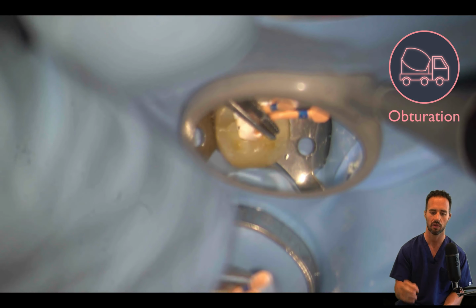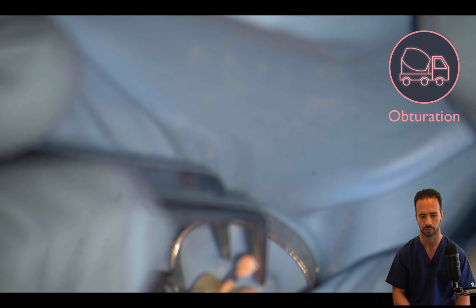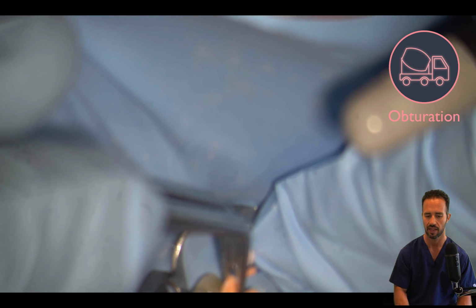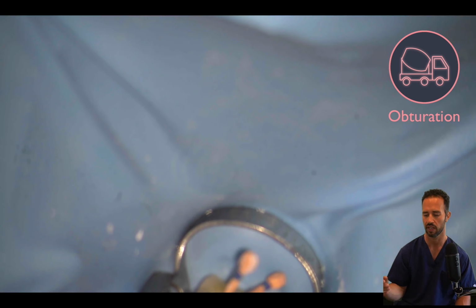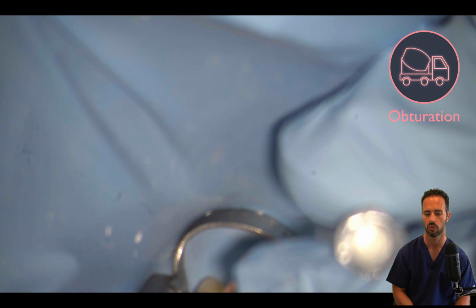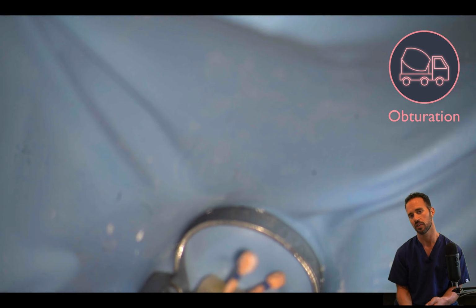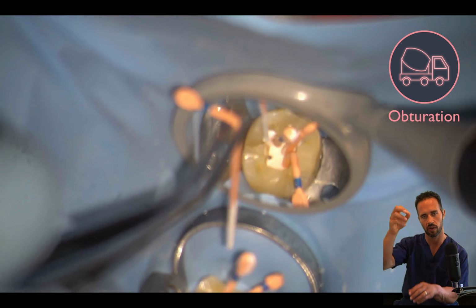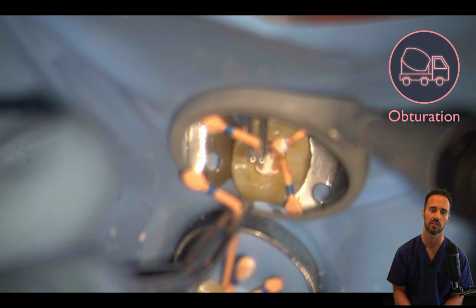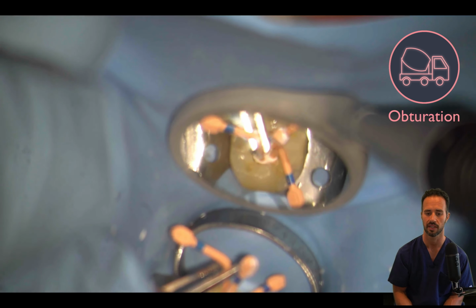And now we're seating our 30 cone into the distal buccal. It's looking good. I'm just needing to grab it and make sure that it's seated all the way. And then finally, we're going to introduce our last 30 cone into the distal lingual canal. And again, that's a merging canal as well. So that will not seat all the way. It's only going to be seated to the point where it merges with the distal buccal. All right, so you just want to take it to the point where it meets it.